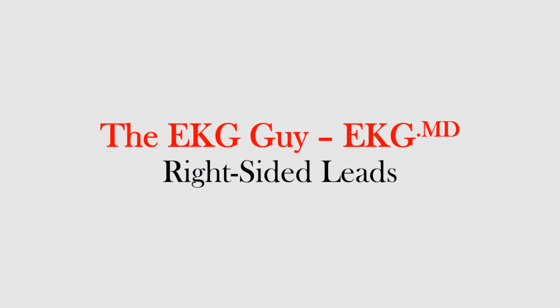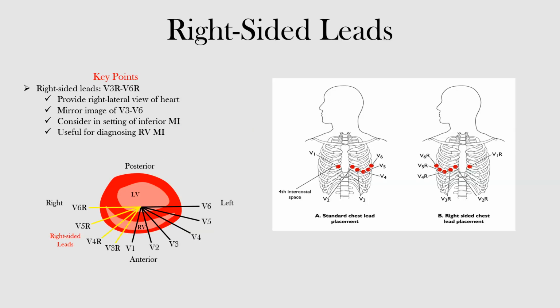In this lecture, we will discuss right-sided leads, including their placement and clinical significance. The right-sided leads are not part of the standard 12-lead ECG. Rather, they are additional precordial leads that can be useful in diagnosing right ventricular infarcts, which are not uncommon in the setting of inferior infarcts.